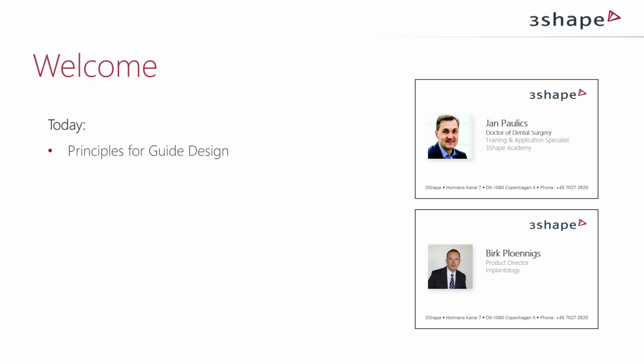Myself, Birk, I'm the product director for implantology at 3Shape, and I'm taking care of the Implant Studio team. Today's webinar, as said, is about the guide design. It's the first series we're going to have as part of our webinar after the summer break. I can already say this is going to initiate a number of webinars we're going to run later this year.